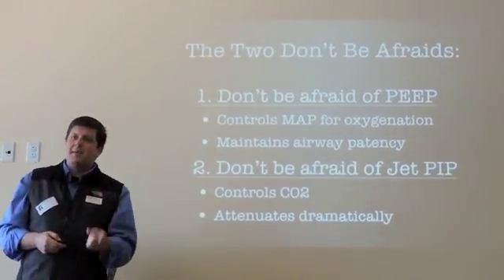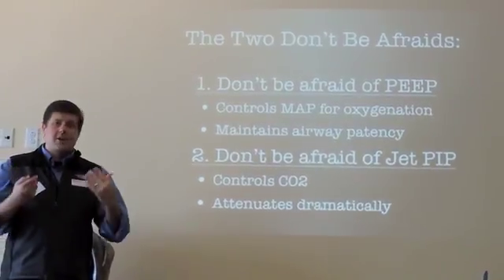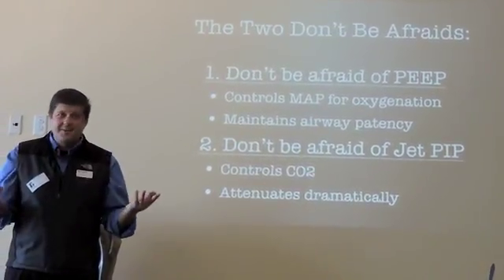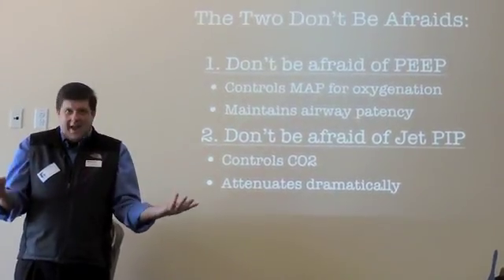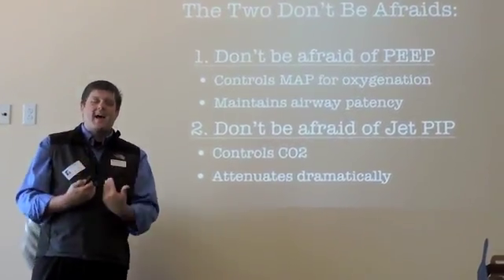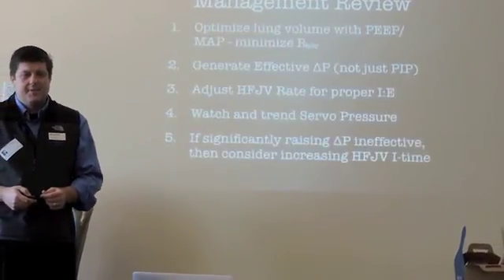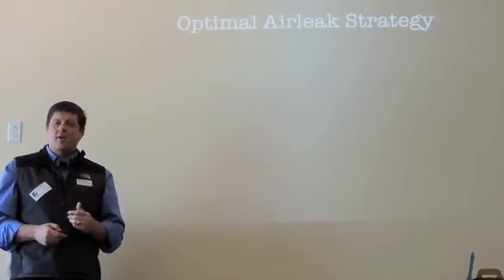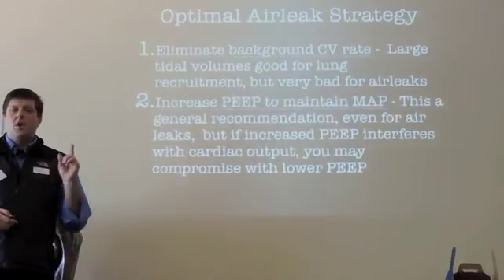Don't be afraid of the jet PIP. If you need to be at a PIP of 35 or 40 to get good chest movement, it's fine. You've got to go to 45? I hope you don't have to, but if you have to, it's all right, because remember how much that pressure drops off and dampens. And then optimally, when we're taking care of these air leak type babies, we want no background rate.